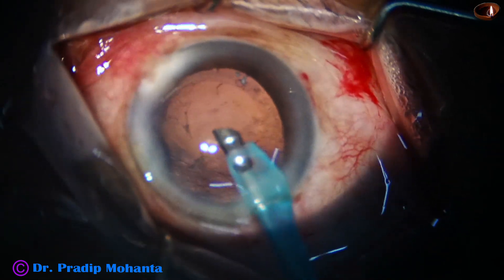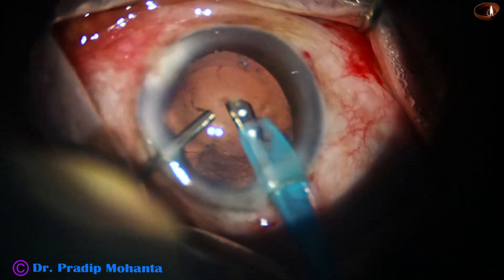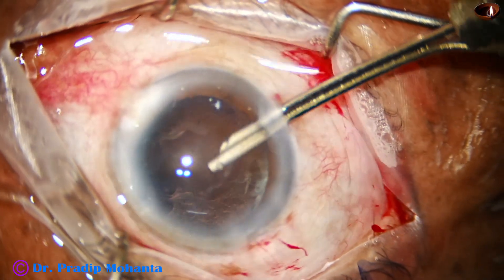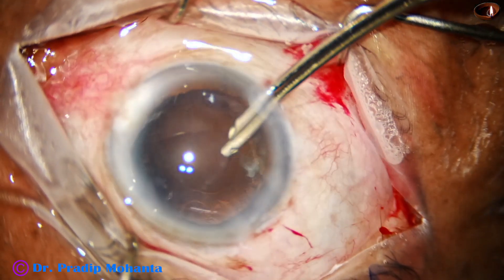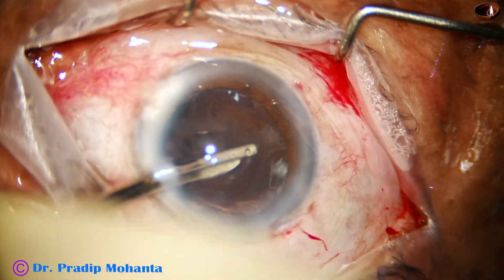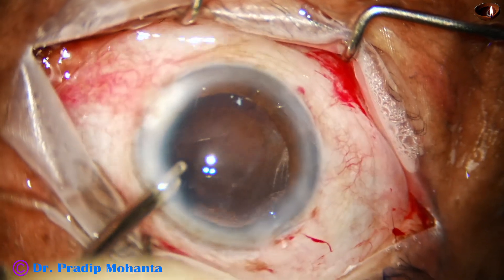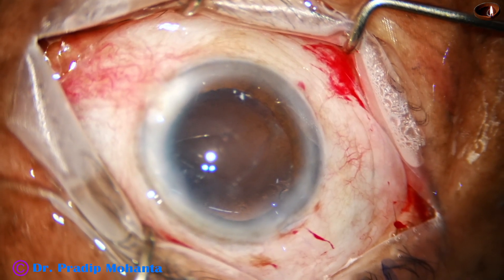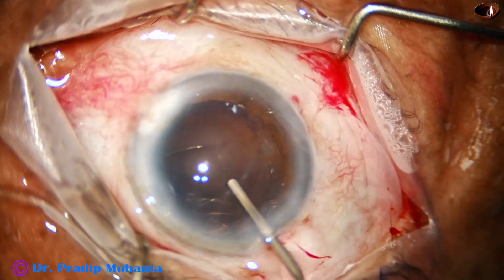The nucleus is managed. Before I come out, I stop irrigation and ask my assistant to inject visco — done nicely. Then I remove the cortex going through the sideport at 8 o'clock. Some more cortical cleanup is done going through the sideport at 2 o'clock.